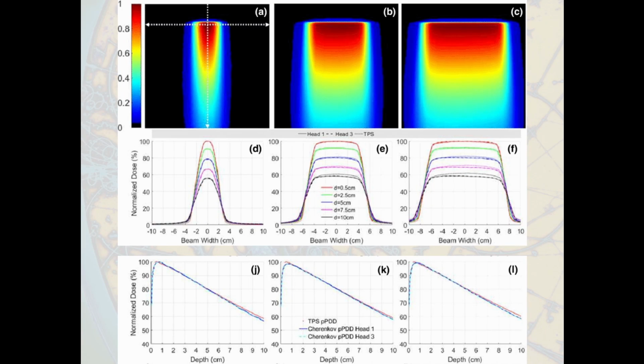So what do we have? You see there some results of the dosimetry. So this is the z-axis, the depth axis, and the field that has been used here might be something like, let's say, a 5 by 5, a 5 centimeter wide beam. Okay, you see that if you look at the dose with respect to the depth here, it will rise up, then fall down due to the beam absorption by the water.